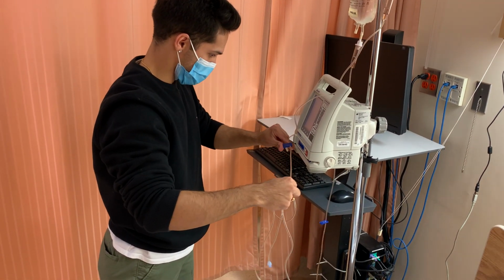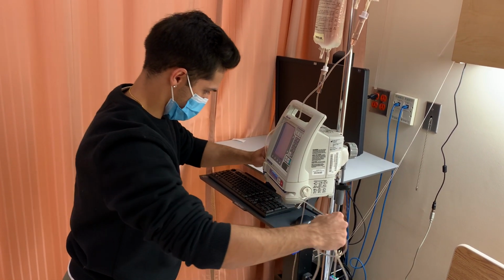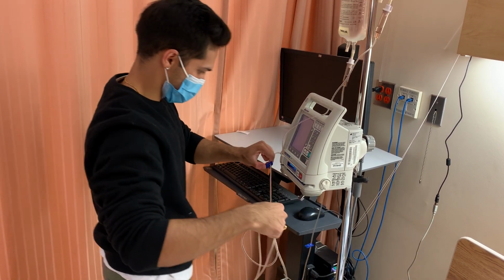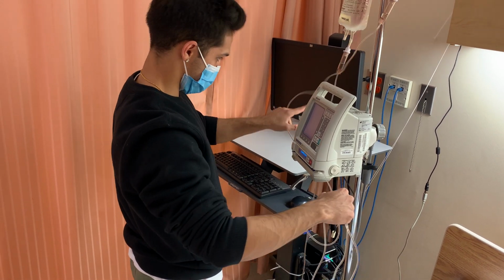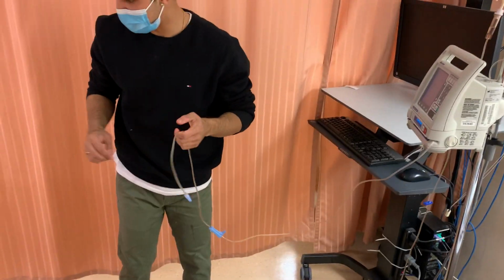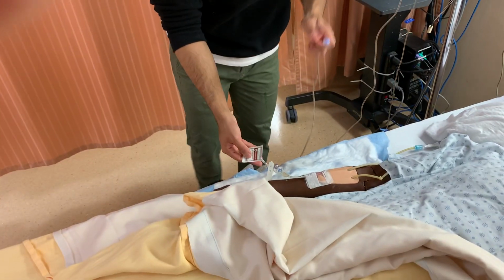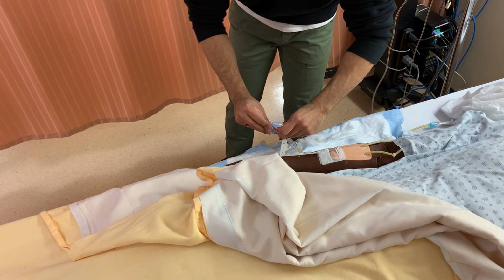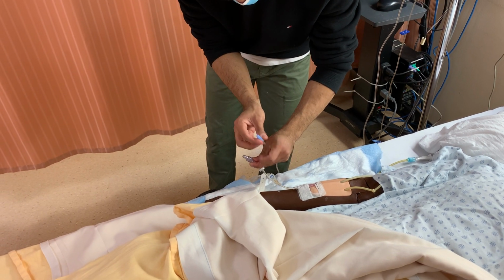I'm just going to go through my own work again and review it. Okay, there we go. And once I have done that, I'm just going to be using an alcohol swab to clean the site. I'm just going to change out my bag, and clean the site.